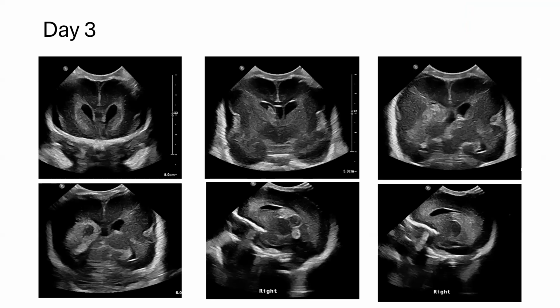There is right ventricular, everyone still hear me? Yeah, thank you. Go on. A little bit of ventriculomegaly. I don't know if the size is increasing a little bit. And if you go further, I think there is a triangular shape or hyperechogenicity on the right side. Maybe it is intraparenchymal hemorrhage. Yeah. And on the sagittal, also in the choroid plexus, also like a hemorrhagic infarct.